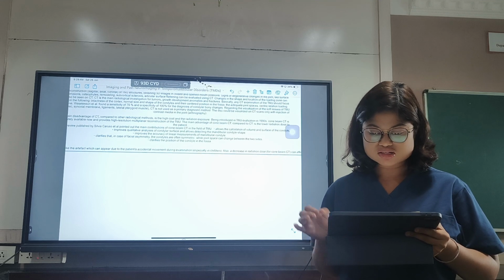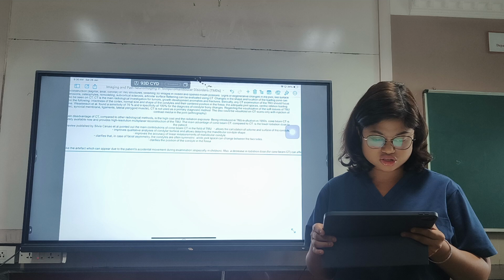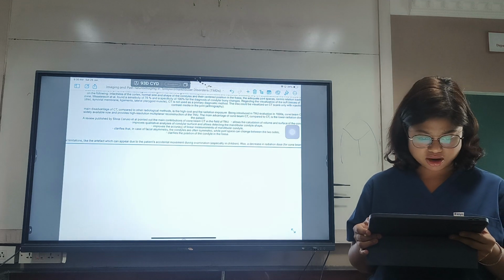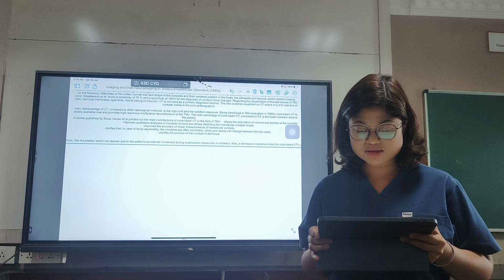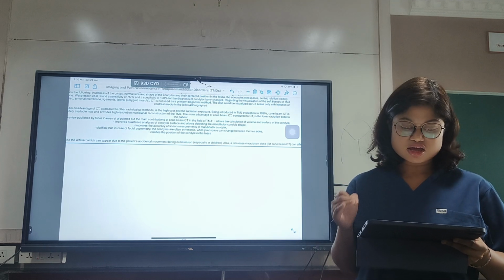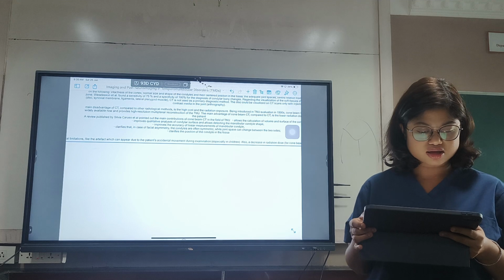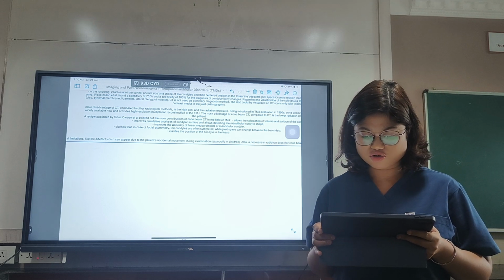So, seeing these disadvantages, CBCT was introduced in the industry and it is widely available now and provides high resolution multiplanar reconstruction of the TMJ. The main advantage of CBCT compared to CT is that the radiation dose is lower compared to normal CT scans. And in a review published by Sylvia et al., they pointed out the main contributions of CBCT in the field of TMJ.